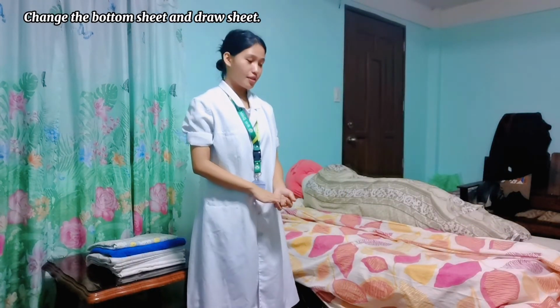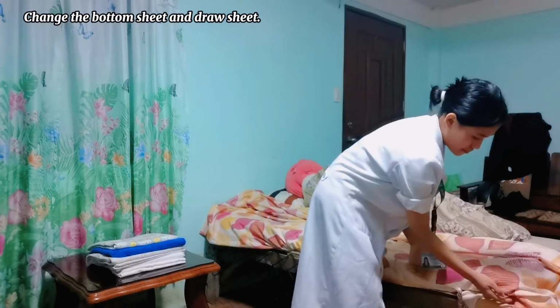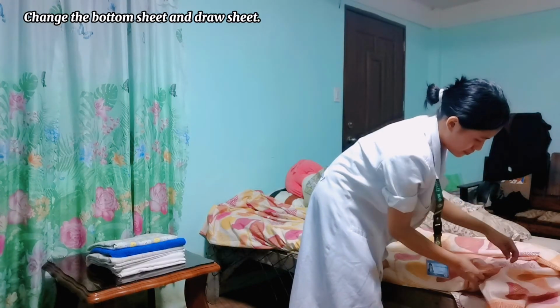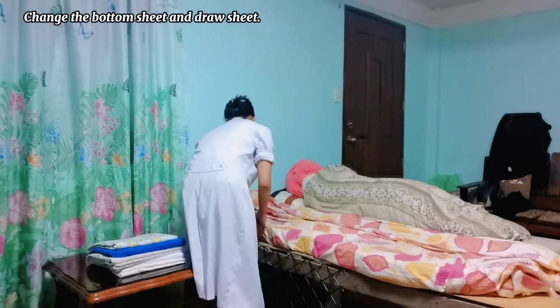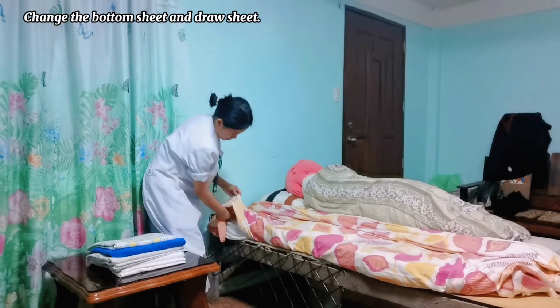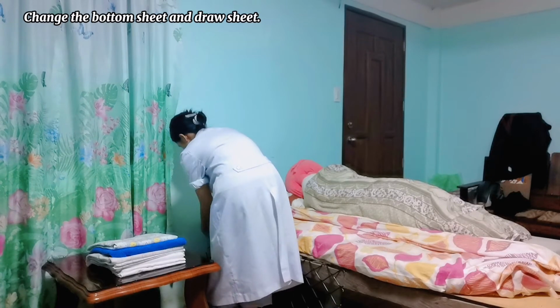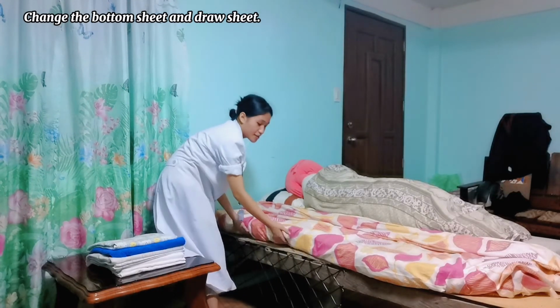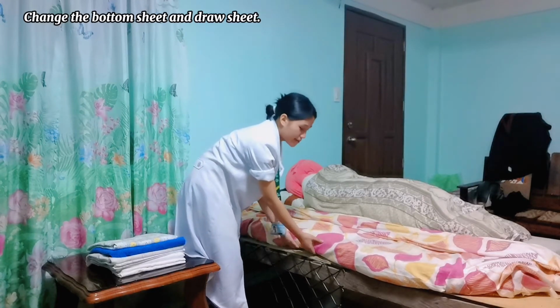And then tuck in the edges. And also miter the edges. Make sure to tuck this sheet securely.